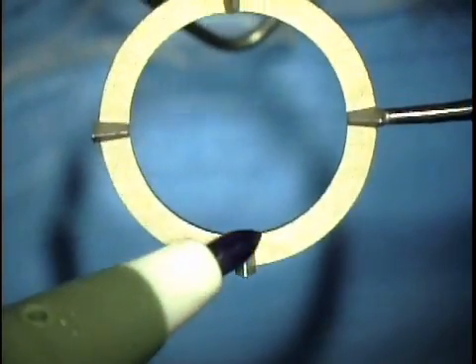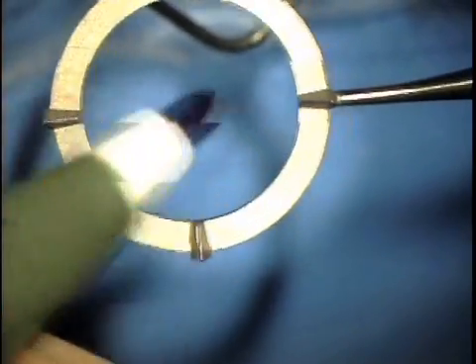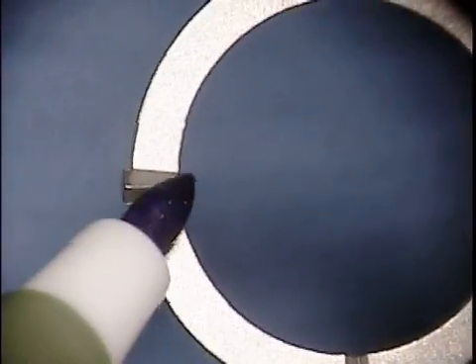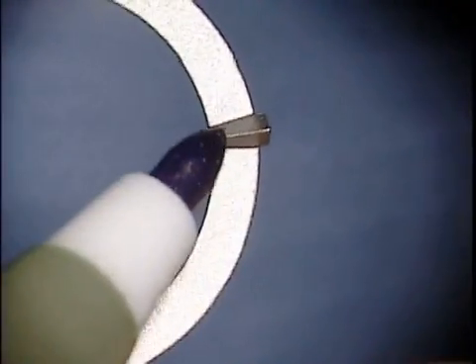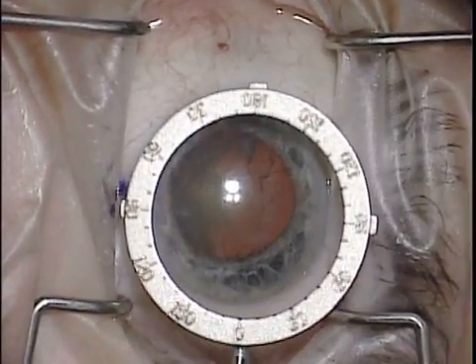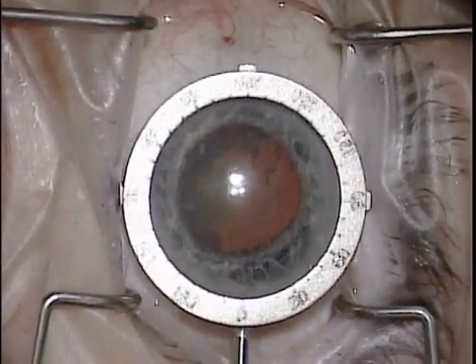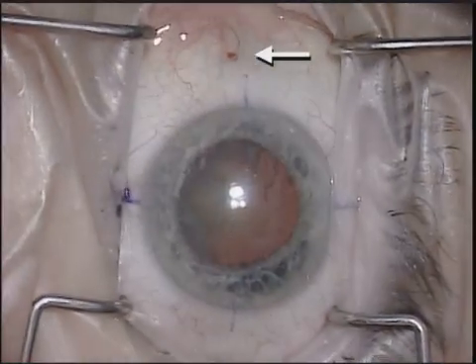In the second case, the cardinal axes were also marked by inking the bars on the degree gauge for precise placement of the temporal corneal incision. The four bars also elevate and help maintain accurate centering of the degree gauge on the cornea. In this instance, the cardinal axis lines created were also compared to anatomic features noted in a photograph of the eye taken preoperatively to doubly assure correct axis alignment.